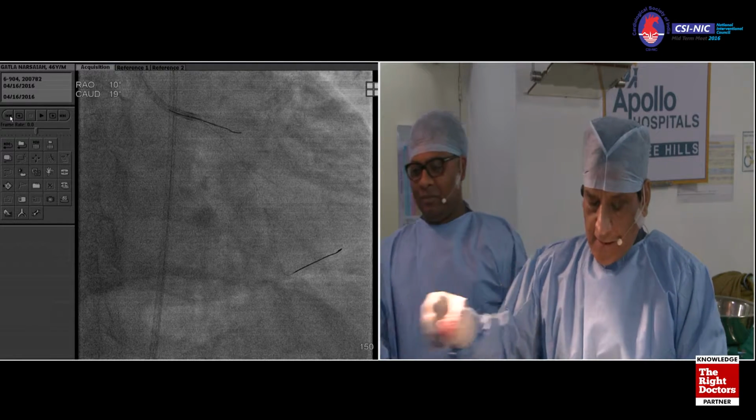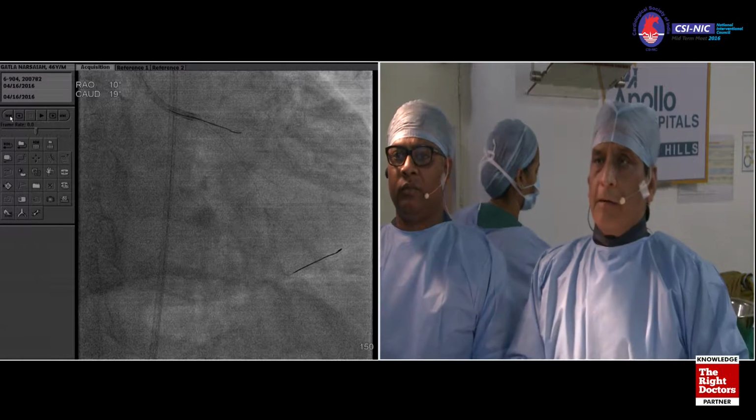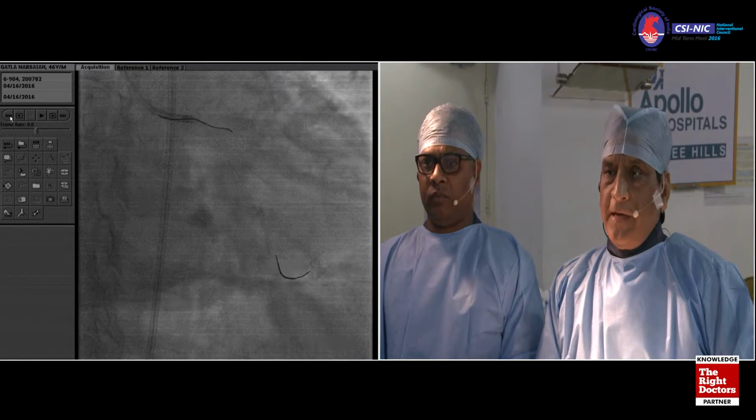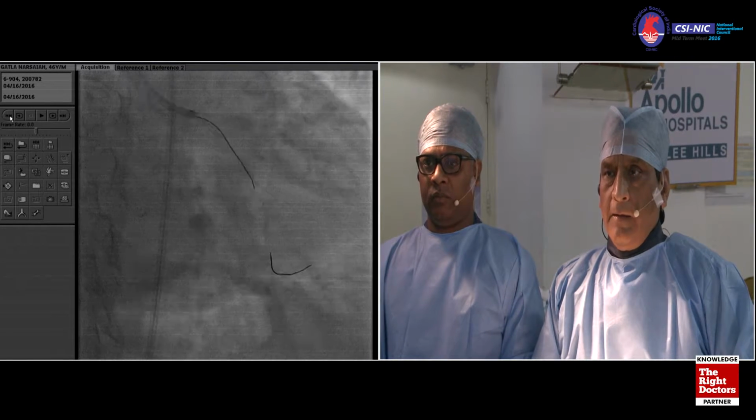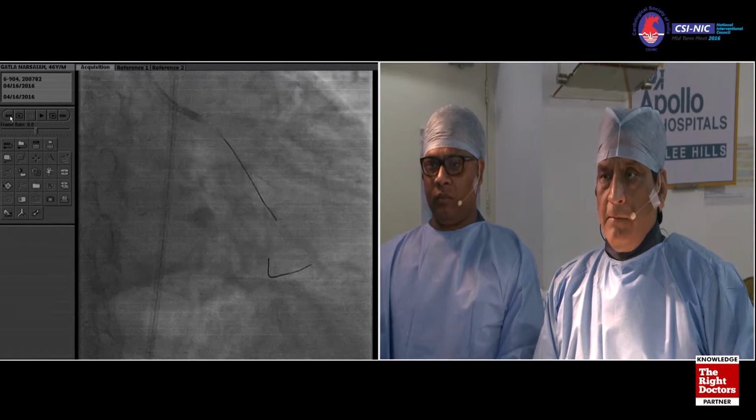No, but I think if you think it has gone, it was not a difficult one, one try going to a different strut depends on who is doing it. Yeah, I would still give that advice first. Yeah, let's get a 1.5 balloon now.